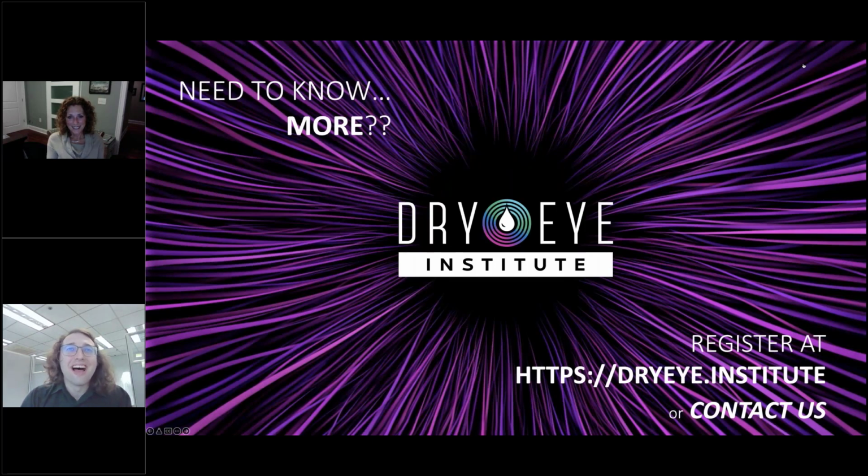All right. How long do you wait between applying dyes like fluorescein or lissamine green to the eye before imaging? How long do I wait to apply them before imaging? So we do, on the Worklist, when I had my collage up, we do everything in the order it comes up. And we get to lissamine first. So here's the best way to explain this. Whatever test you want to do, you save it as your work list, and it's going to put it in the appropriate order for you.